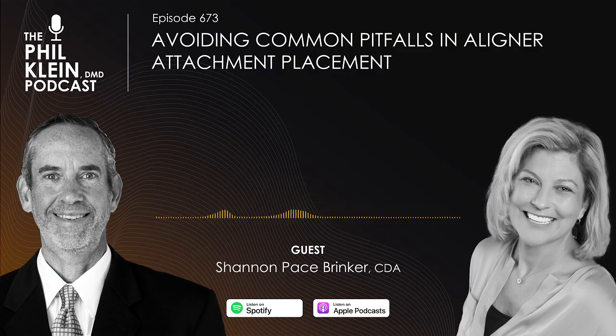Well, Phil, I tell you, this is probably the most important question out of the gate. These attachments really are critical. And when I say that, we always think about brackets and wires with conventional braces. We have to put forces on the teeth, and these attachments have to be placed so precisely, but most importantly, we have to have that attachment be the exact shape as the attachment template is designed.